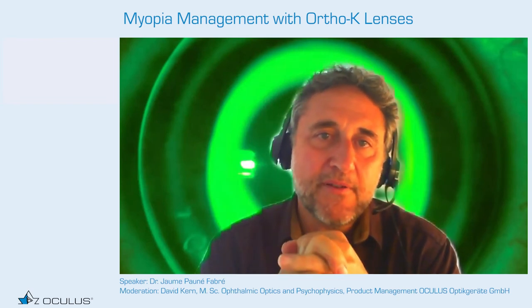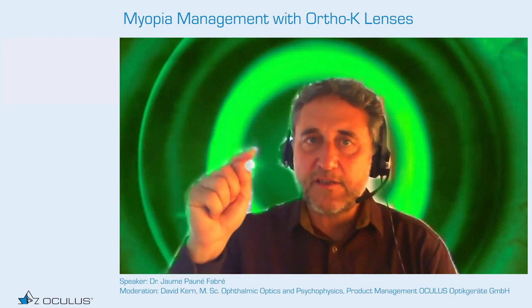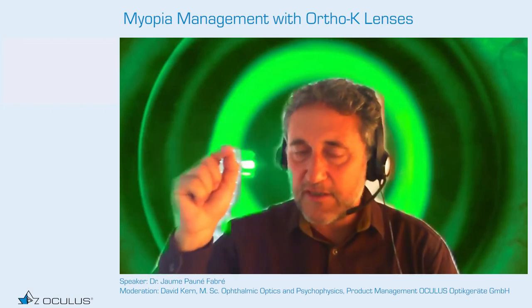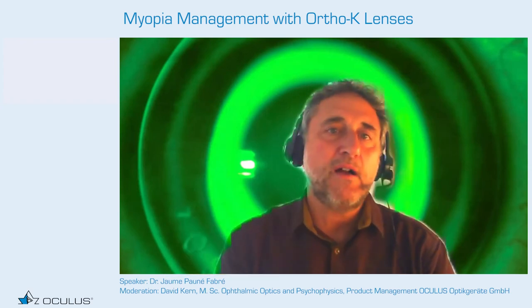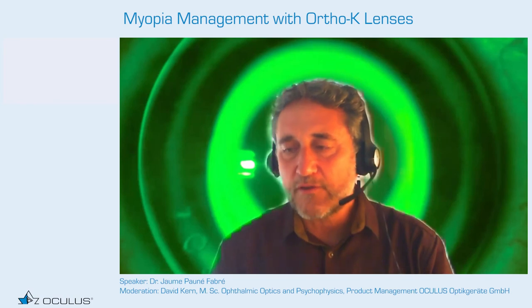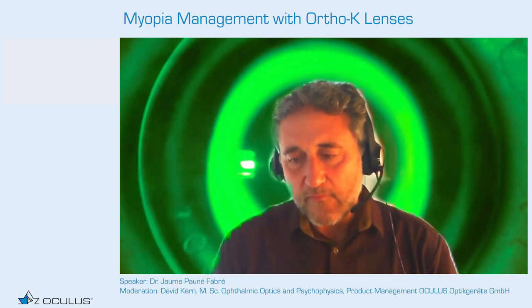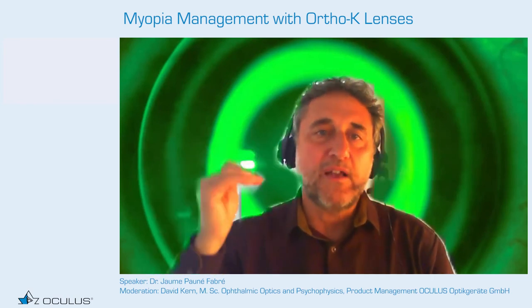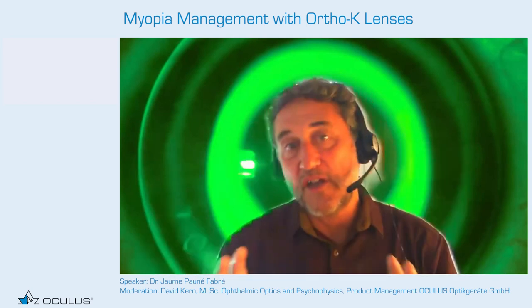The second point is we have mainly two kinds of maps, axial map and tangential or instantaneous maps. Axial map is the map that the studies use to measure that plus power ring, but it's not accurate because it's not the real power, it's the distance from the surface to the axis. And the distance from the axis to the point on the cornea is not the real radius and not the real power. This kind of map is used for the refractive maps. So refractive maps and axial maps give a lower power than the real. Tangential maps could provide more power than the real with this kind of Placido system. But I prefer to use tangential or instantaneous maps because it's the true shape of the cornea.